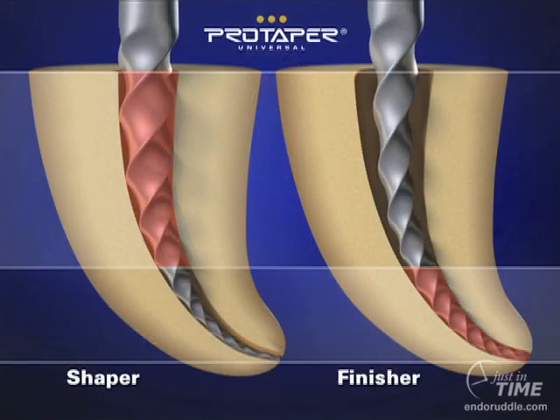In 2001, ProTaper launched, and it launched as the first active file in the world. It was also the first file that had changing tapers on a single instrument. It was also the first system in the world that could give you the fewest instruments to create an ideal deep shape of about 8 to 10%. The fewest instruments to create the most optimal deep shape.